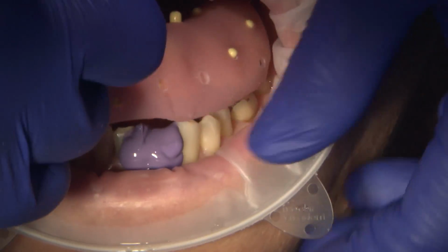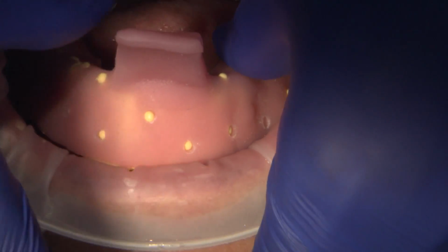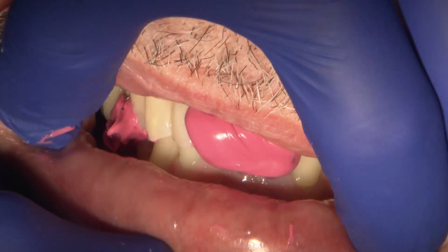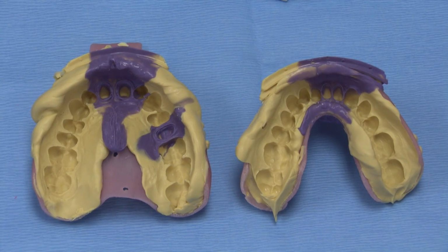Next, we'll seat the impression tray. Once the impressions are completed, we'll then apply some bite registration material over the preps. That way it helps ensure the lab can accurately mount these models to establish the proper occlusion for these restorations.